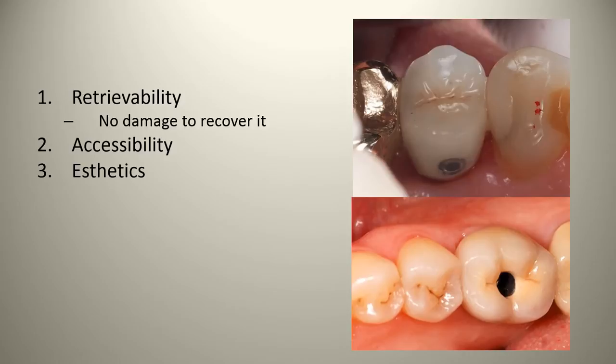However, many times this is difficult for us to achieve, and so you have no choice but to go with a cemented restoration. There's also the option of cost. In some labs, a UCLA abutment or some sort of screw-retained crown is going to be much more expensive than using a prefabricated abutment, either using it the way it is or customizing it with a burr and taking a conventional impression and using conventional crown and bridge technique for cementation of that crown. Cost can be reduced by using this sort of method.